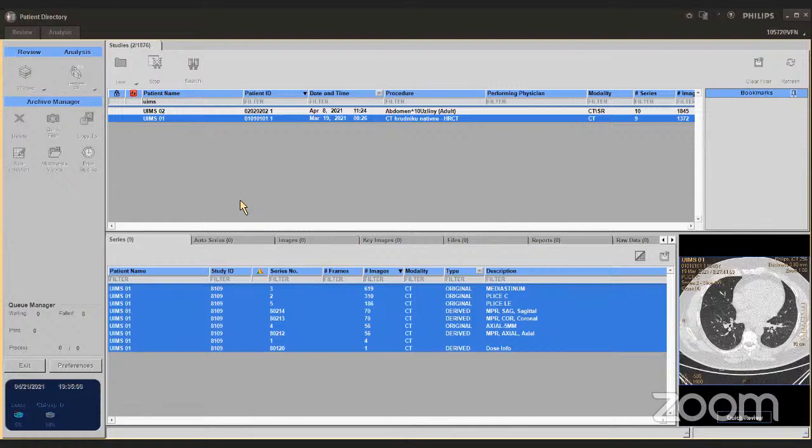And what do we do with the thin slices? We also have these slices, for example. They are not 1 millimeter, which is not that bad, but we usually have 5 millimeters. I'll show you this one. If you compare these two images, you can see that this is the thin slice and this is 5 millimeters.